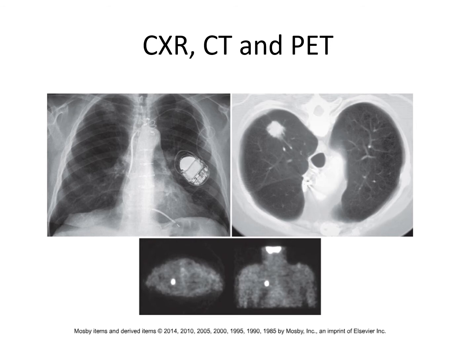So again, they fast for several hours. This glucose is injected as a radiopharmaceutical labeled sugar water, and the patient needs to remain supine, so they need to be laying down and they need to be perfectly quiet for about an hour. So what happens is that metabolically inactive tissues, so just laying there doing nothing, you're metabolically inactive, you're not going to use up that much sugar water, okay? So it's not going to be drawn to those areas.